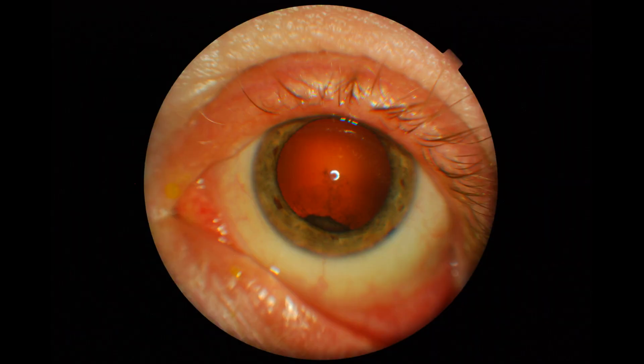On slit lamp exam, there was a small nuclear cataract in the right eye and a cataract of a similar nuclear density in the left eye that certainly does not really explain the large myopic shift. But there were also inferior sectoral cortical changes, and the inferior lens and iris were possibly slightly displaced anteriorly. And the anterior chamber depth was uneven and certainly shallower in the left compared with the right eye.